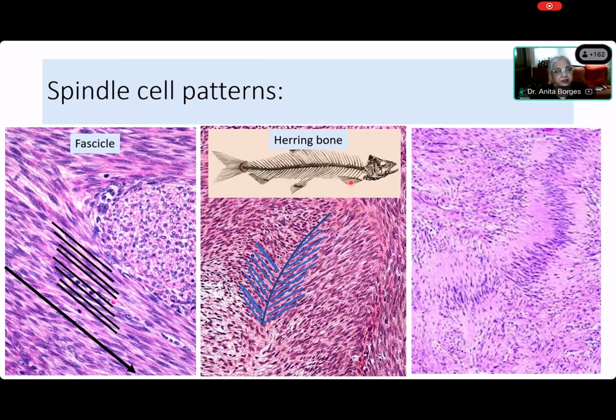Very good. Come on. First of all, is this a spindle cell lesion? Ma'am, I think this is palisading pattern. You think it's a palisade, so define it. Why do you think it's a, how do you define a palisade? Ma'am, individual cells are arranged parallel to each other vertically. Vertically means what? We just saw a fascicle where the individual cells were running parallel to one another. You're right, I can see them running parallel to one another. So why isn't it a fascicle?